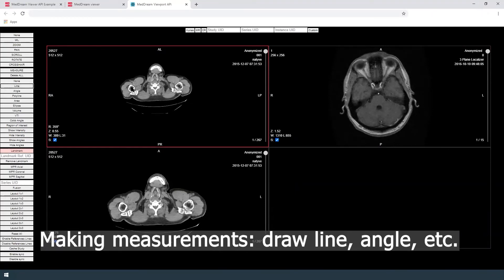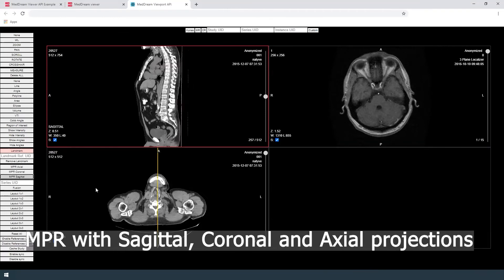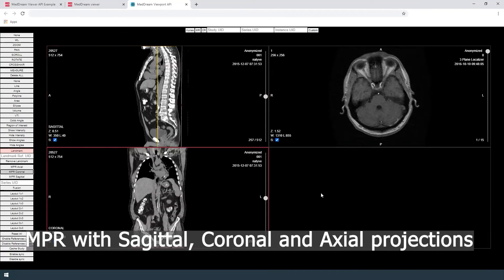The user can also make measurements such as draw line, angle, etc. The user can also use multi-planar reconstruction features with sagittal, coronal, and axial projections.